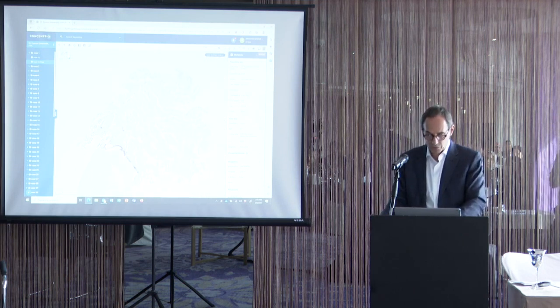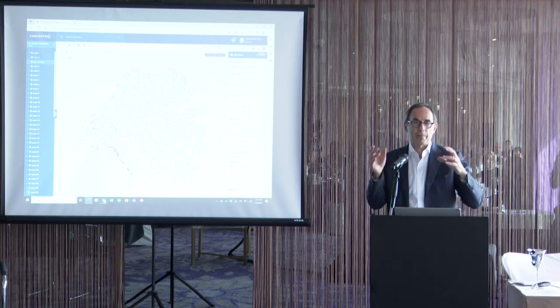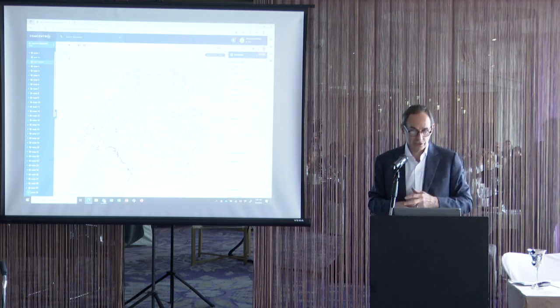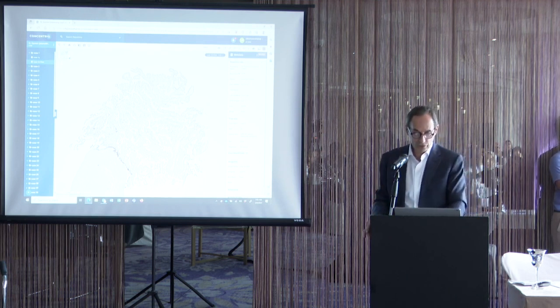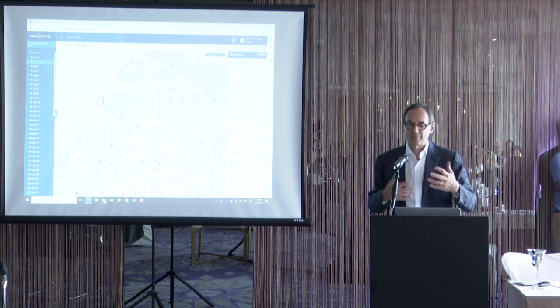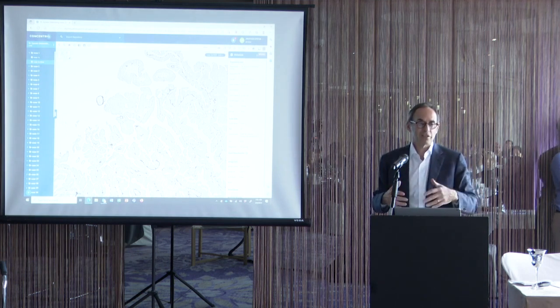Ductal adenocarcinoma also can present very distinctly. So in a case like this, it's going to be a papillary tumor projecting into the urethra. To the urologist, this is going to look like papillary urothelial cancer, not like prostate cancer. The patients present with hematuria, normal rectal exam. So again, everything looks like it's a urothelial cancer. So be prepared that when you tell them this is prostatic ductal adenocarcinoma, they are going to be potentially confused and maybe say that doesn't make sense, and you have to explain this type of prostate cancer can manifest and present like urothelial cancer, but is in fact prostate cancer.